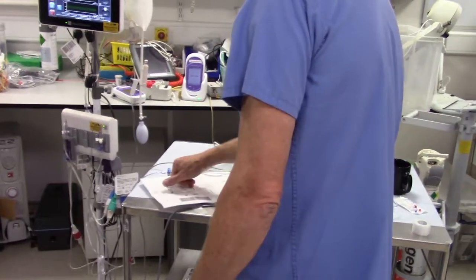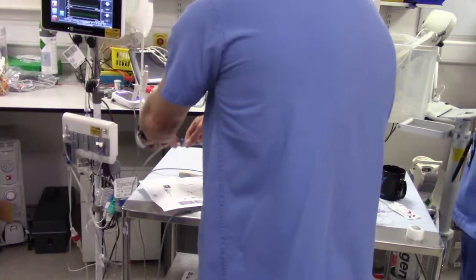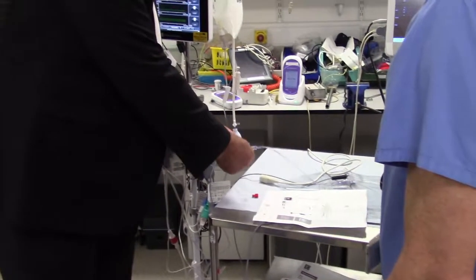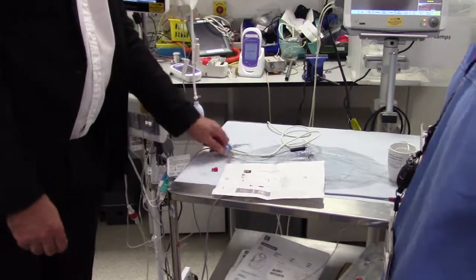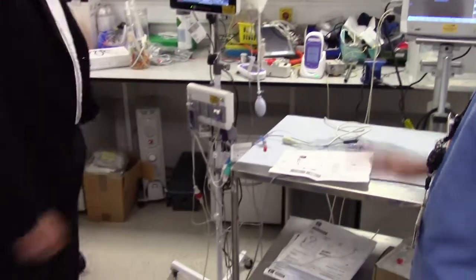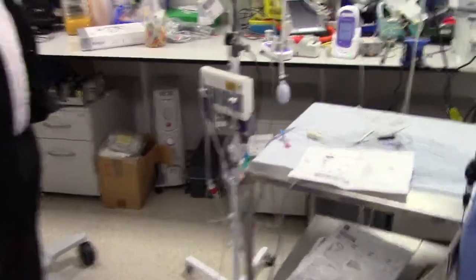So you've got your manifold here with a temperature port, but you've got that additional bit there before you get to here. Unless someone's added that in, because that's not part of your set then. No, okay, fair enough. I saw it set up like this. It's literally been taken off the patient as it is. I assume that's how it came out of the packet, but if that's something they've added in, that's not okay. Fine, that's all right.